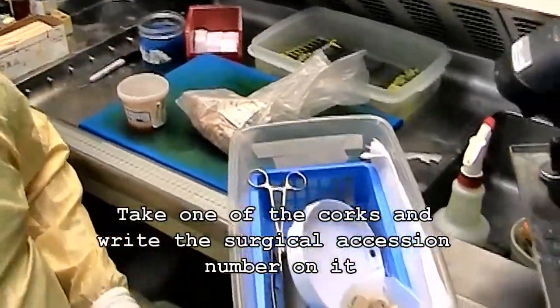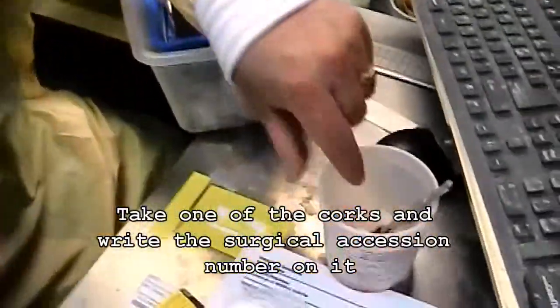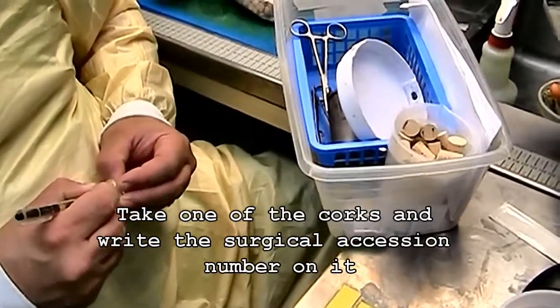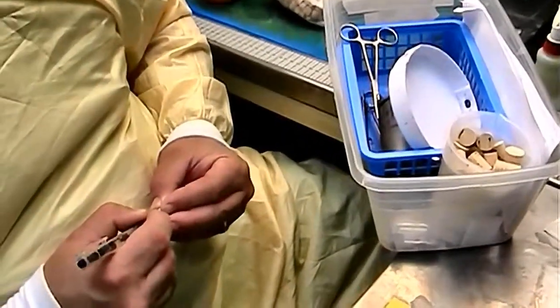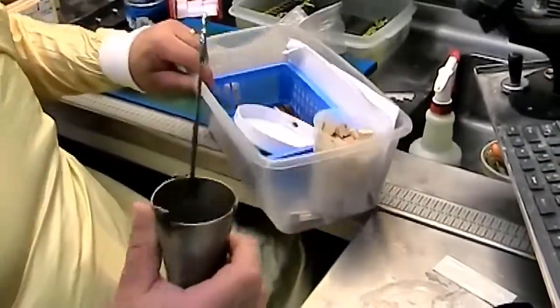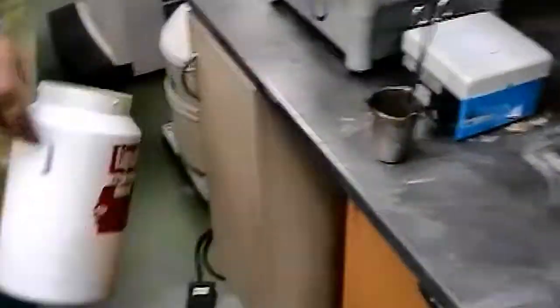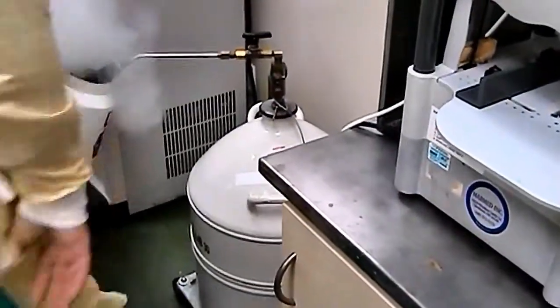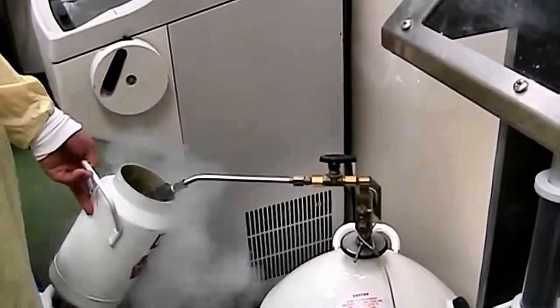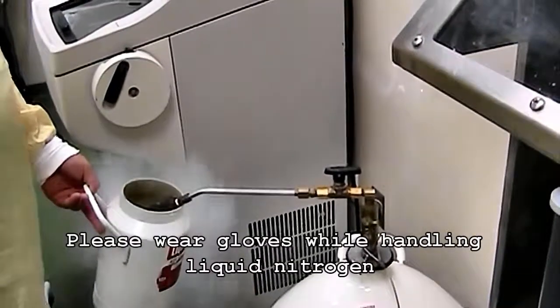and write down the number on the cork. Ballpoint pen works. Your container for your 2-methylbutane, and we'll get the liquid nitrogen. It will burn you. Don't try this at home. How much do you need?